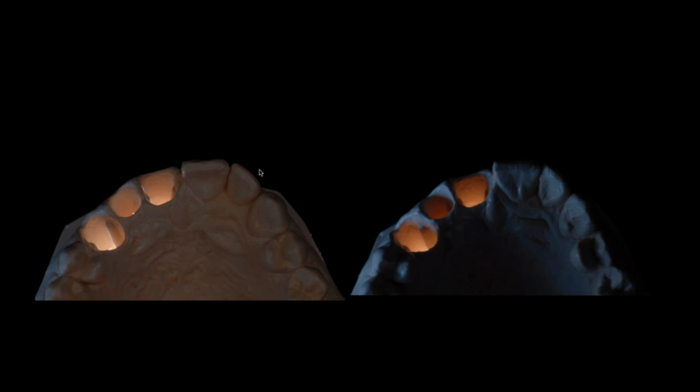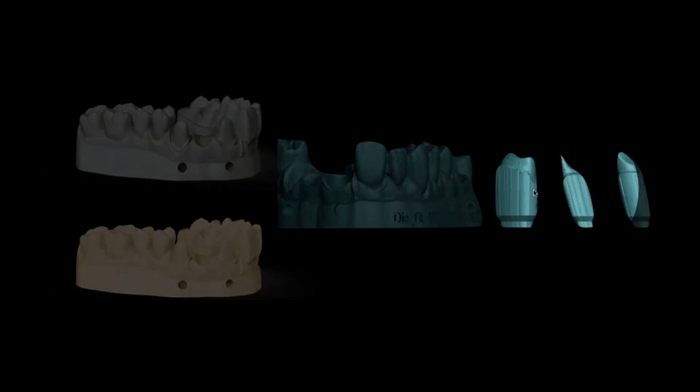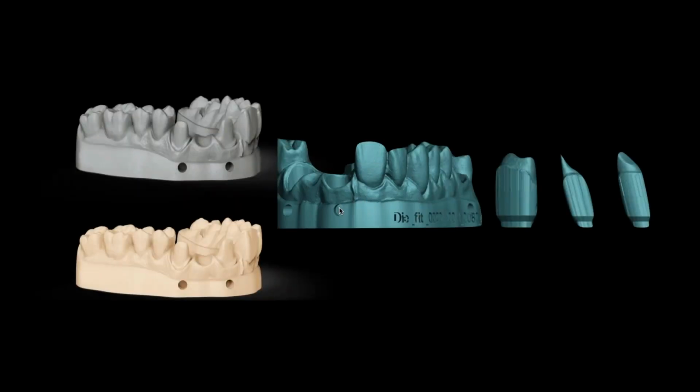And I now have the ability to do that in the printed world, which is really cool, that I can actually print this, and then I could take those dies and either utilize them as a resin material, or I can reduplicate them and turn them into a refractory material and still go back to old school refractory veneers, which, by the way, we still do a lot of here in my office.